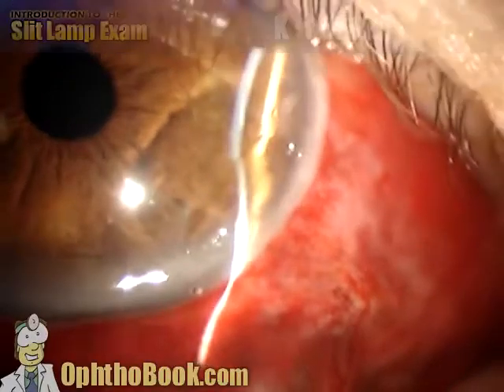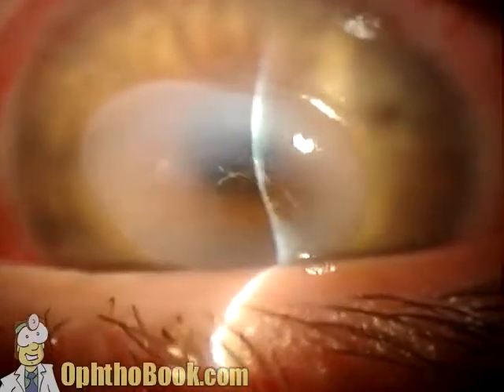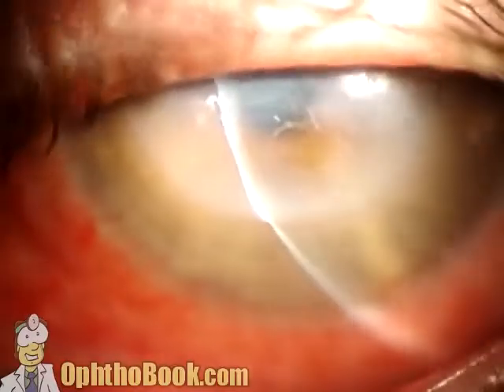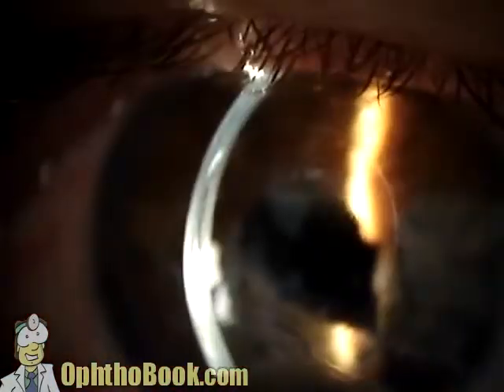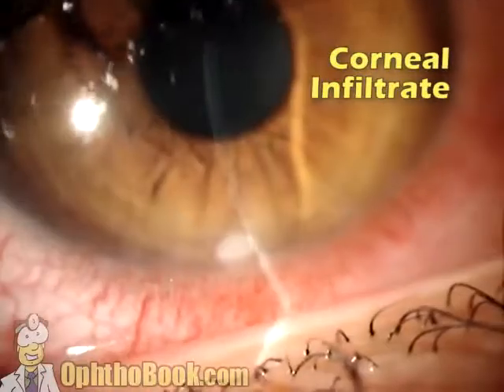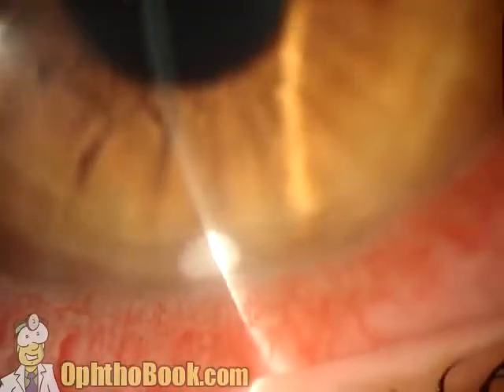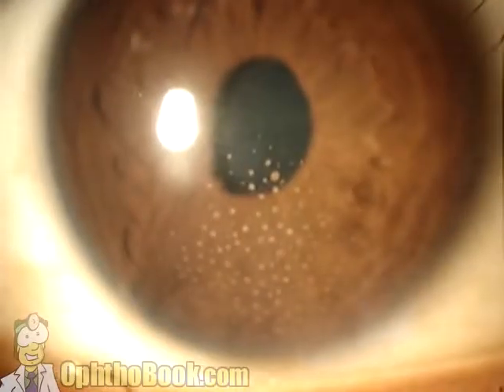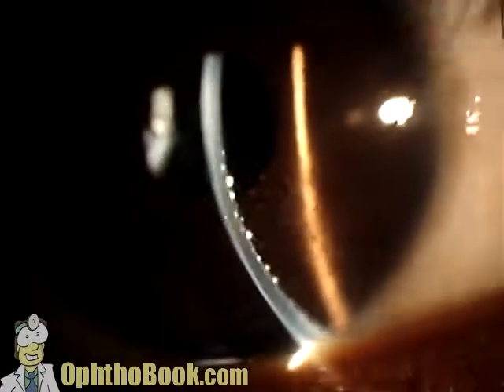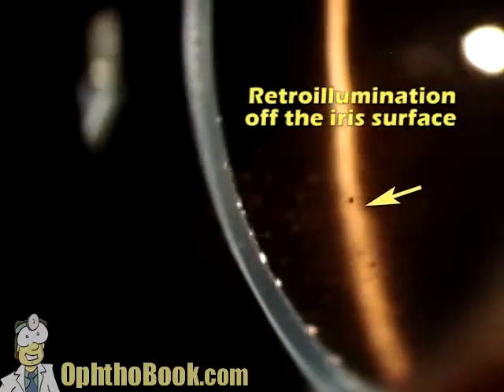This is hemorrhagic chemosis — actually blood under the conjunctiva that's bulging forward; it's impressive how far forward the conjunctiva can bulge. Moving on to the cornea: this is a dellen, an area of localized dryness that has caused thinning of the cornea in one little spot — hydrate it and it thickens back out again. This is a corneal ulcer thinning right in the middle — you can see it thinning with the slit beam; it ended up perforating a few days later. This is an experimental intrastromal lens from about 15 years ago — the cross-section shows a dark gap right in the middle of the cornea. This is a corneal infiltrate probably related to contact lens use — it's on the front of the cornea, amenable to antibiotics. This is KP splattered on the back of the cornea, confirmed by the slit beam, and you can even use retroillumination off the iris to see those dark spots.